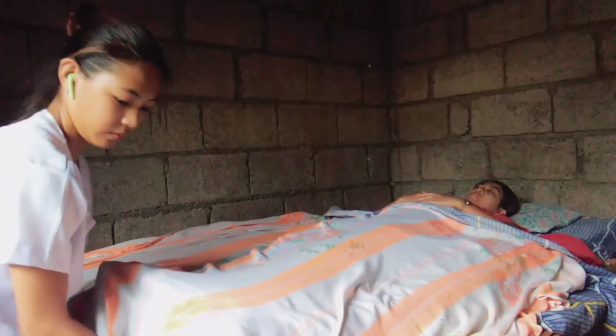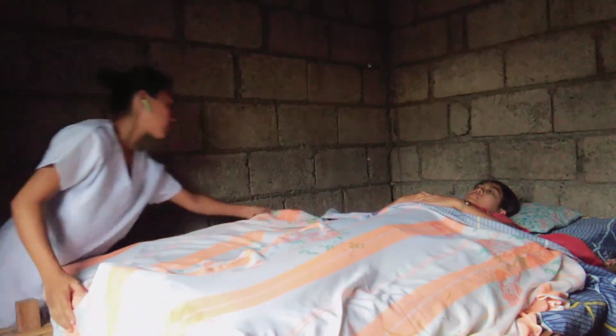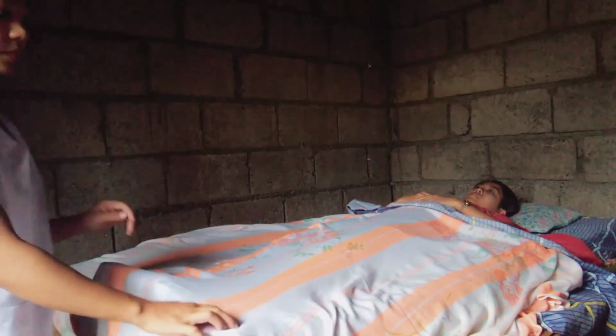At the foot of the bed, lift the mattress corner with one hand, while with the other hand, tuck all the top linens together under the mattress, and repeat the step on the other side of the bed. Now, take the pillow from the patient's head, remove the soiled pillowcase and discard it in the hamper.